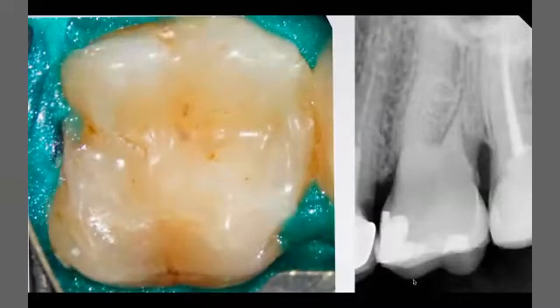Another case, also an upper molar, with a completely calcified pulp chamber, but the patient has symptoms. She has pain on percussion. She cannot bite on this tooth. She came to me and said, I cannot bite on this tooth, I have severe pain. When I did the percussion test, yes, it was very severe. And I think if we took a CBCT for this case, we would find a periapical lesion on the distal root, because I can see some periodontal ligament widening there.